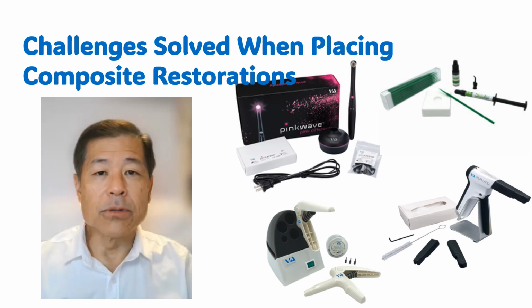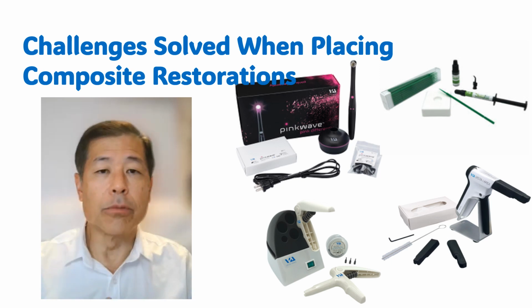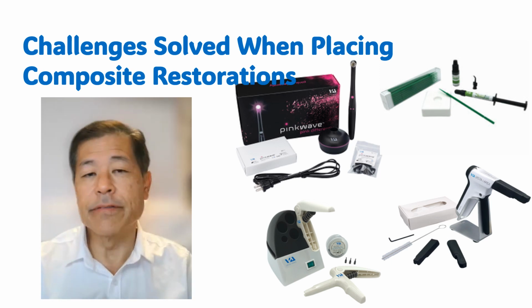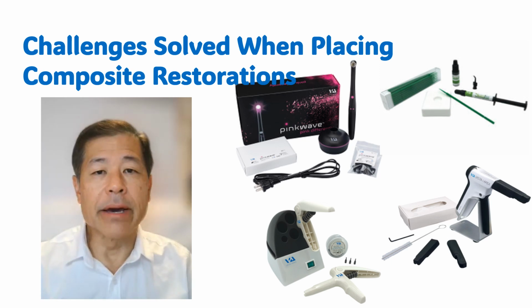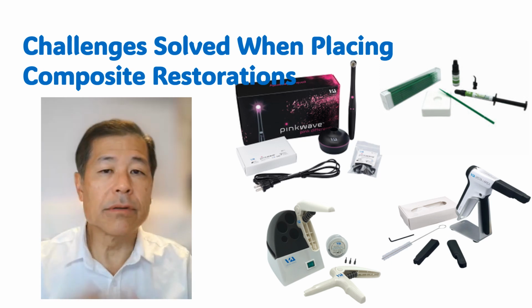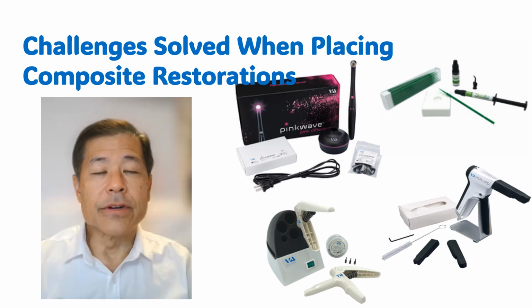That composite gun will stay on, so if I put it down and I'm shaping my composite, when I go back to it, it will not have shut off as long as I get back to it within a couple minutes. After a couple minutes, it will shut off to save the battery. Just hit the button again if you need to, and it's going to warm up very, very quickly. The Phasor is very nice to use.